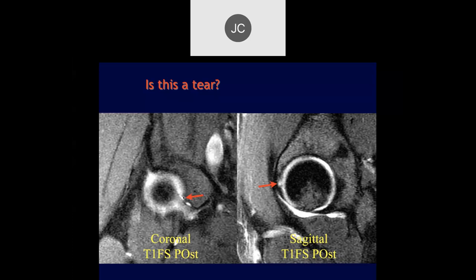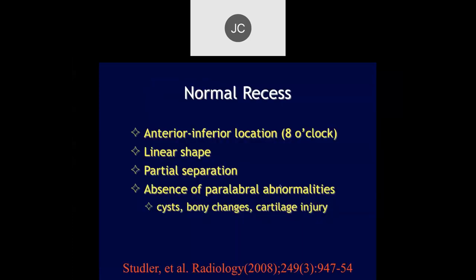When we look at other images, this was actually a normal recess. The typical normal recesses, commonly seen in the anterior inferior location around the eight o'clock position, are linear, look like partial separations, and don't have any surrounding abnormalities. So very far anteriorly and very far posteriorly, if I see that, I'll usually either ignore it or describe it as a chondrolabral separation, most likely a normal recess.